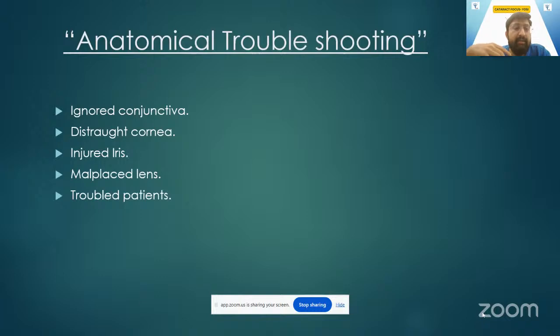So holistically, when you try to imagine as a fresher that incision is just another beginning step, and you can end up taking it lightly, I'm sorry, it is very, very important, right from the ease of the surgery to the astigmatism. The entire process requires these incisions to be nice.